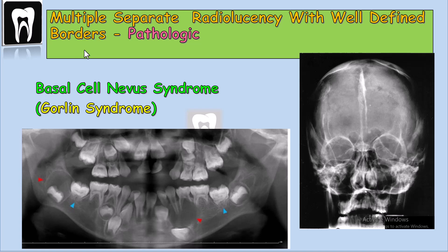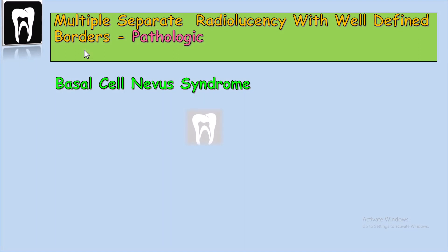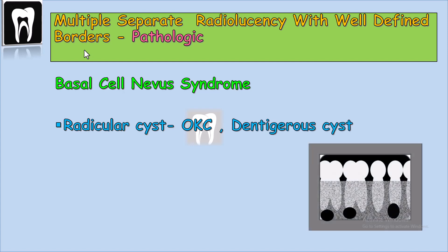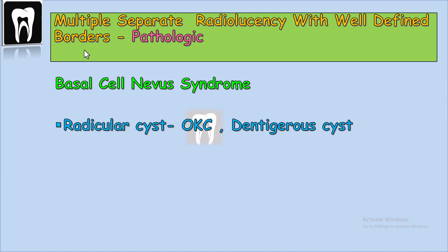This syndrome is also called Gorlin syndrome. In this panoramic radiograph from a child, we can see two cysts inside the mandible around the crown of the third molar and the canine — both cysts have displaced and pushed down the associated teeth. In the posterior-anterior skull radiograph, you can see calcification of the falx cerebri. Both of these findings lead our diagnosis to a syndromic condition. The cysts in basal cell nevus syndrome can be radicular cysts at the apex, or OKC and dentigerous cysts at the coronal of the teeth.